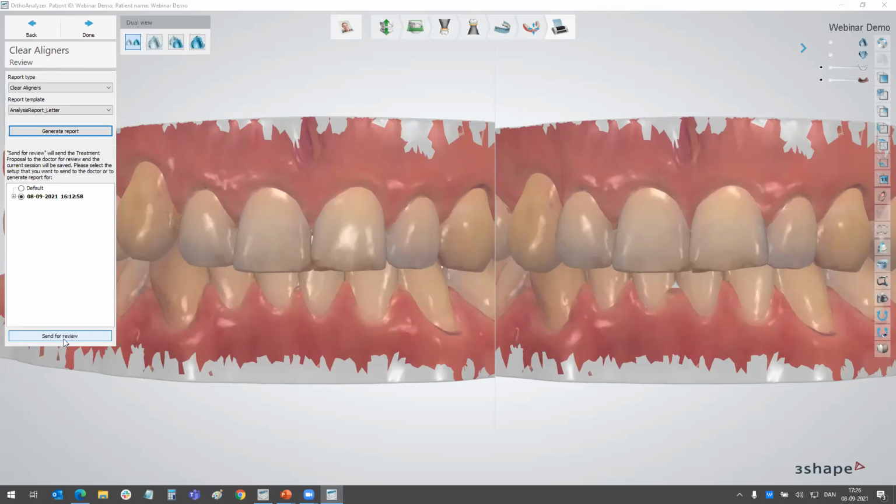There's a question if current users of ACAS will now automatically have 7 points used towards the new features, and yes, all will automatically be upgraded to all the new licenses needed for this new functionality, and they will get their 750.